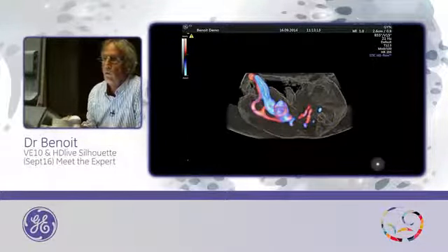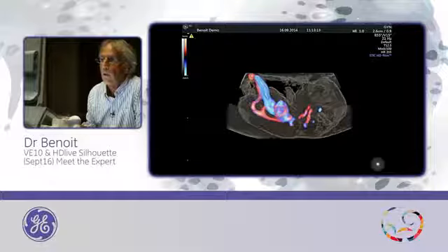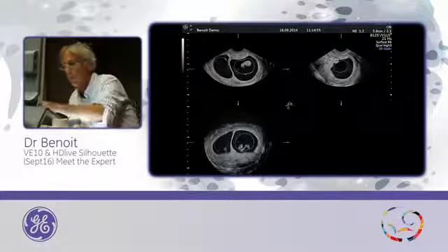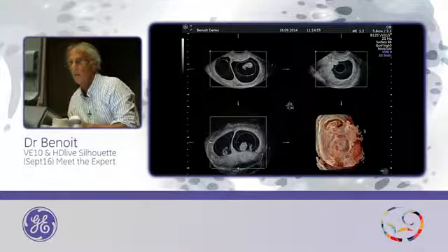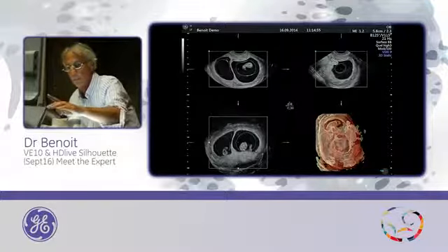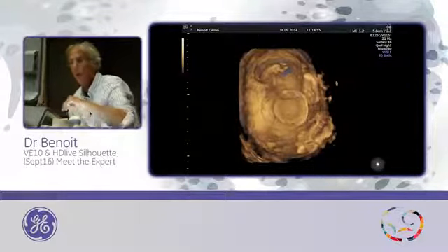So I will try to find a twin pregnancy, dichorionic twins. Okay. Render. Okay, I do the same.